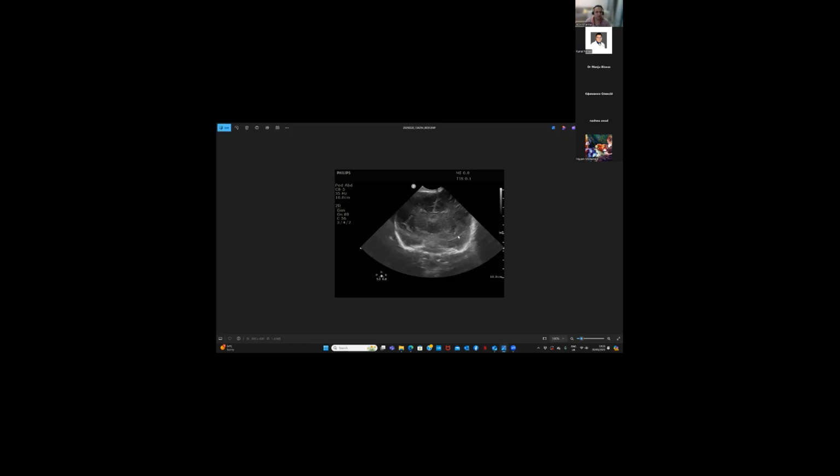Beyond this, it was getting a little difficult. In this part, I think this is the Sylvian fissure, which is disappearing right now. This is the third ventricle. That's correct. And probably here is the cerebellum. It will gradually come into appearance. You're right. Temporal lobes, and then you've basically got the cerebellum that will come into view.